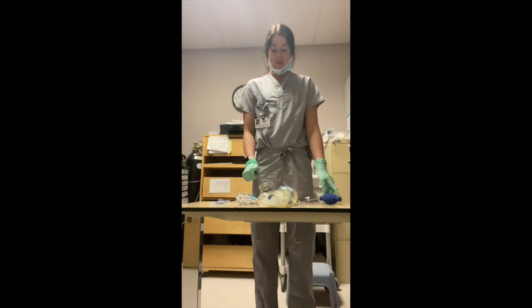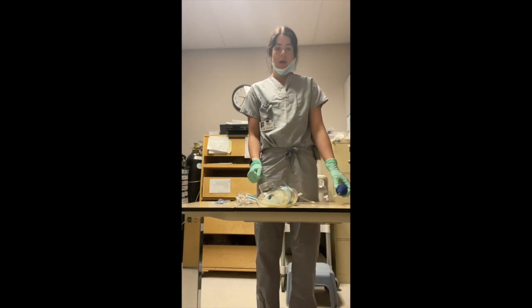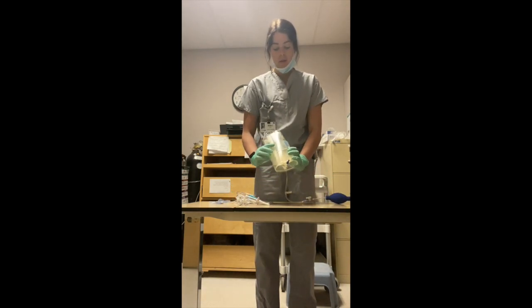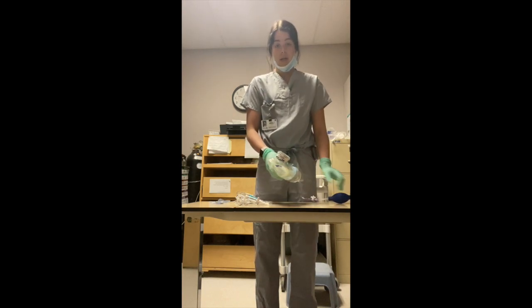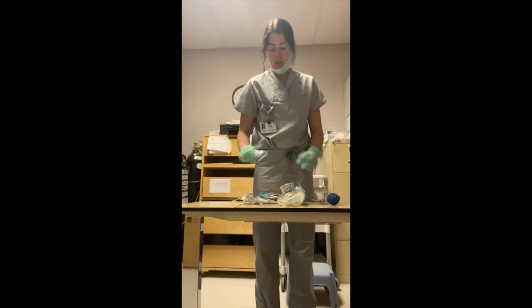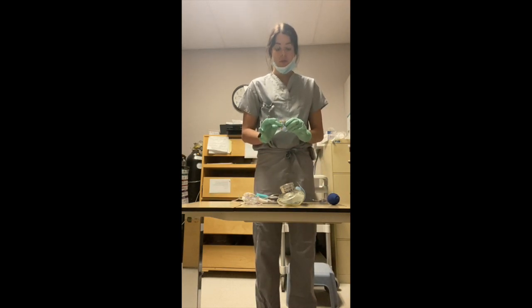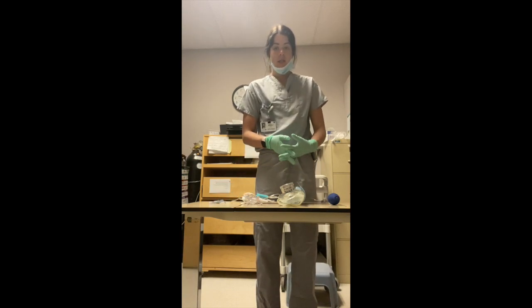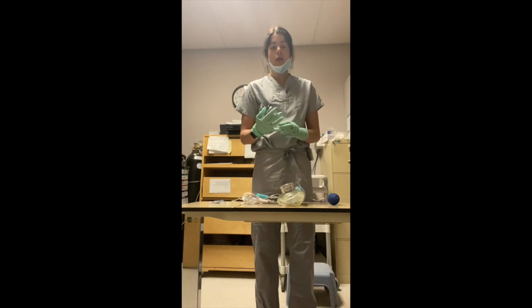For this portion of the video, I'll be demonstrating priming the arterial line. As equipment, we have our 500 ml bag of normal saline, our pressure bag, our transducer cable, and the dead ends for after the line is primed. In addition to this, if it was a real patient setup, we would also have an IV pole and a transducer holder.